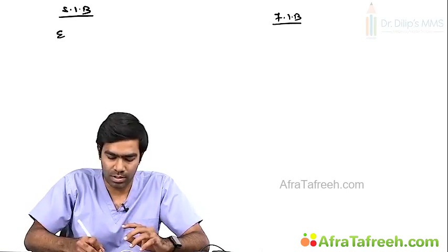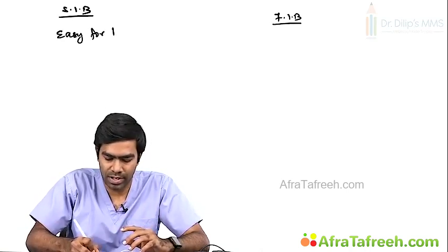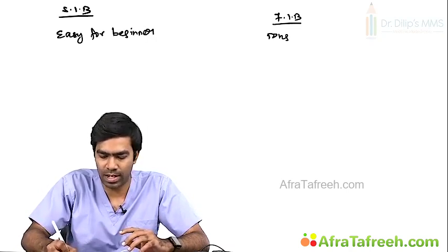So, first, self-inflating bag is easy for a beginner to use, whereas flow inflating bag is very tough, very challenging. It's not that easy to use because you have to adjust the mask properly, because if you leave the mask fit loose, the bag will not inflate. So you have to keep the correct mask fit, and you have to know how much tidal volume to give. It's little tough, it's not that easy. So you need some expertise in that. So it needs some challenging understanding about how a flow inflating bag works.